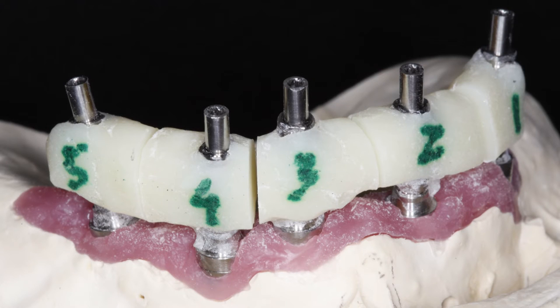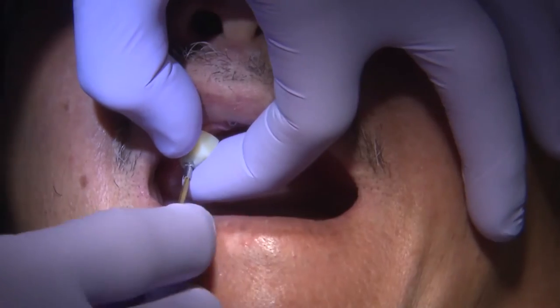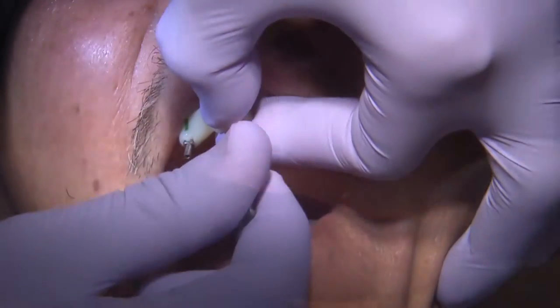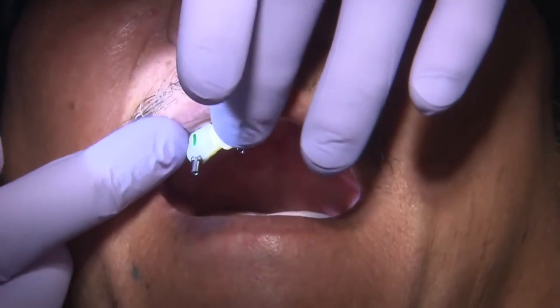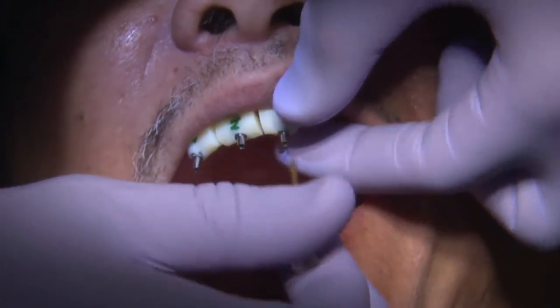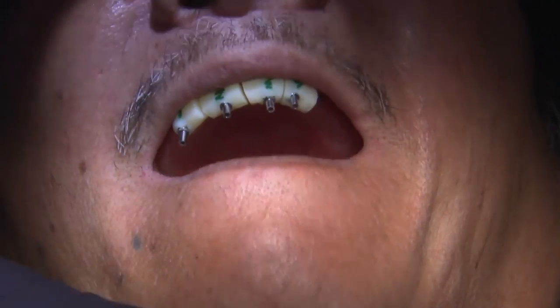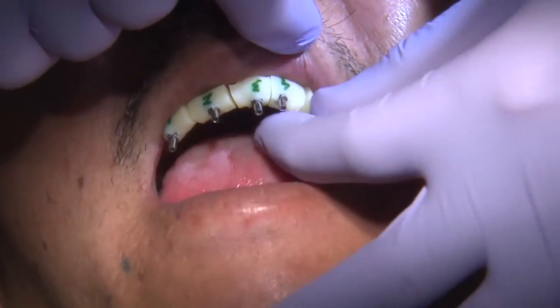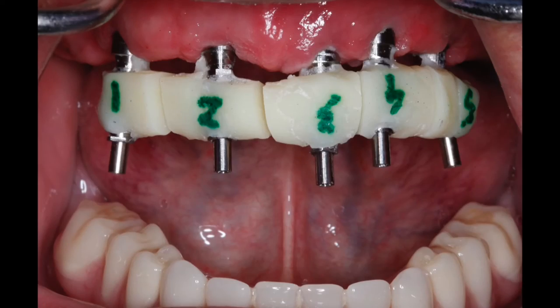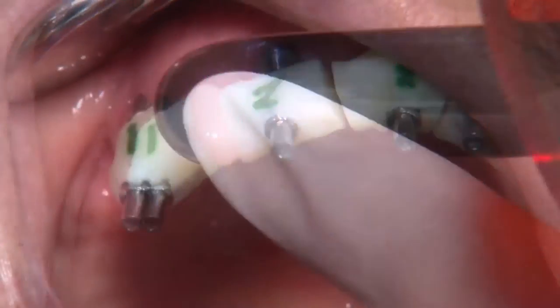In this scenario, we have the jig fabricated from the laboratory along with the custom tray. You can see how nicely the custom tray fits over the cast. One by one, I place the jig pieces in the mouth, ensuring a little bit of space between each jig so I can flow some GC pattern resin or light-cured composite to connect them. The composite is flowable so I can get in between those areas, and once placed, my assistant cures everything.